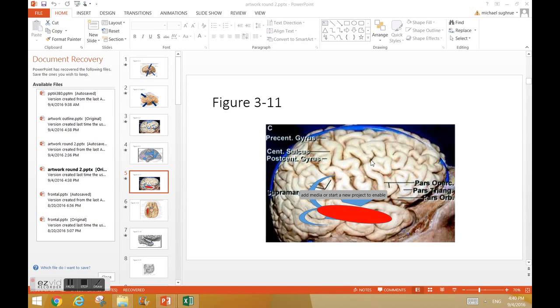Now the SLF is going to be here, and FAT is going to be just anterior to this. And what we're going to do is, after we stimulate and find eloquent areas, we're going to basically subpially resect down into the depth. After we do this, we're going to scoop out the tumor like that, with the SLF on the deep margin.